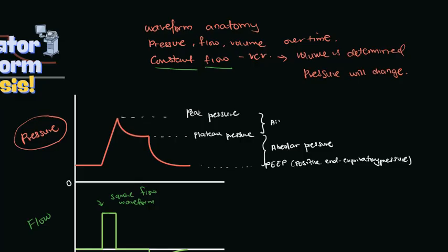Okay, next we can see the peak pressure, which is the highest peak in the pressure waveform. This peak pressure, or P peak, is the pressure due to the sum of airway pressure and alveolar pressure, including PEEP. In peak pressure, I mentioned airway pressure. This airway pressure is obtained by the difference between peak pressure and plateau pressure.